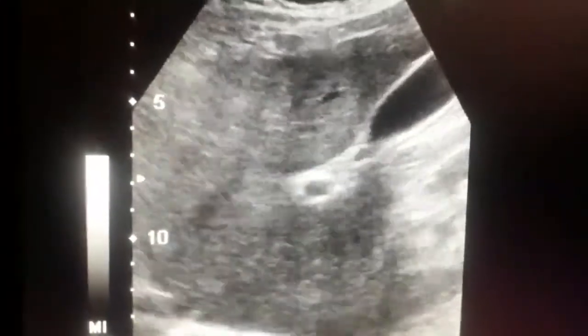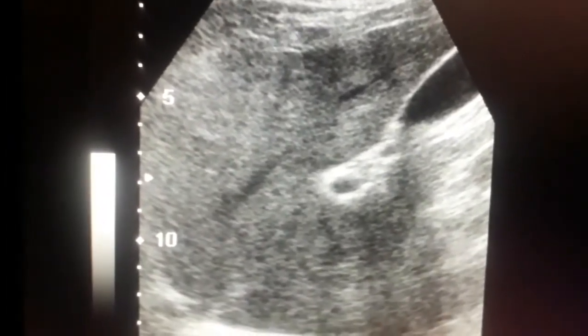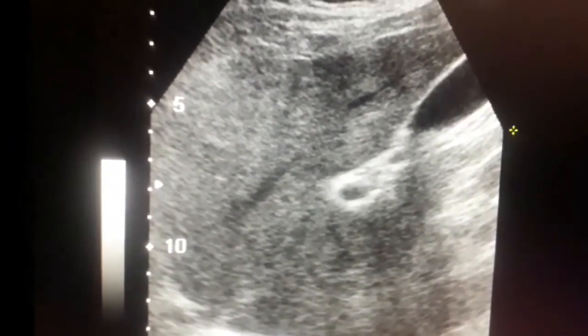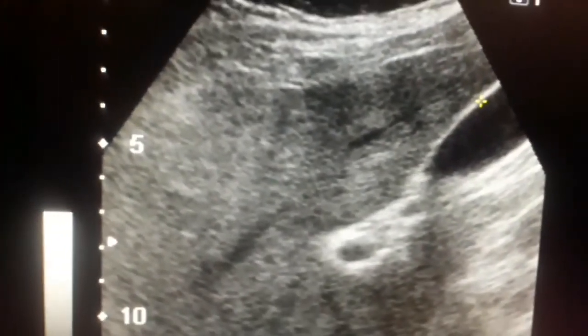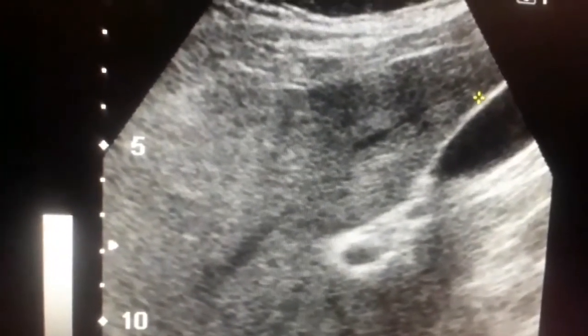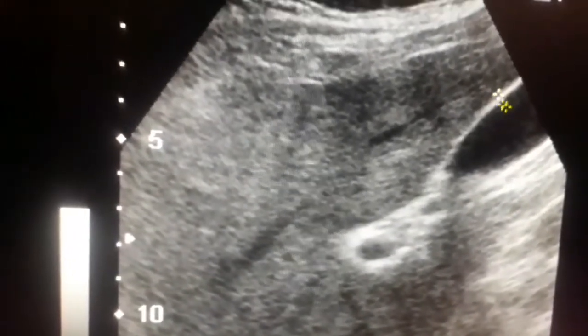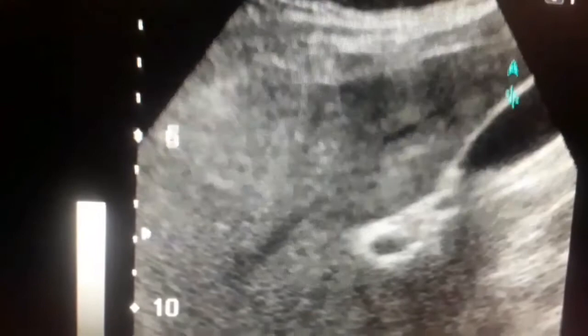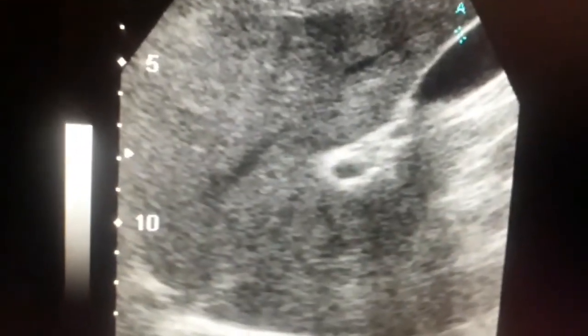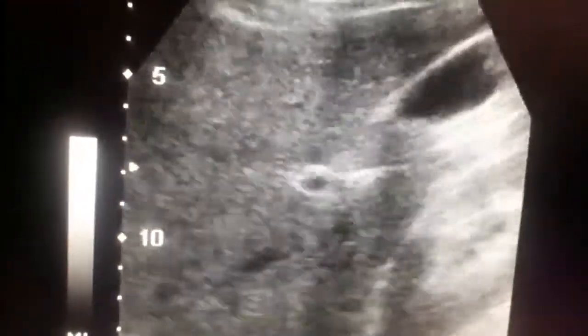This is the gallbladder. The gallbladder has three parts: fundus, body, and the infundibulum region. The wall thickness is very important — it should be less than three millimeters. It increases in different conditions like cholecystitis, particularly acute cholecystitis, where the wall becomes thickened and edematous.